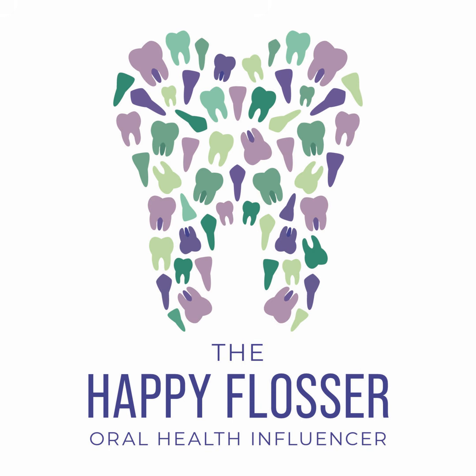The margins tell us a lot about the biology of the lesion. It also tells us about its aggressiveness. So even if you don't know what you're looking at, and that is okay. Honestly, it's okay if you have no idea what it is. The fact that you notice it is the most important part. So if you find a lesion on a radiograph, your job really is to just note that you see it there and then have the conversation with the patient. Find out if they're having any symptoms or if they've noticed anything. Look at the previous radiographs.